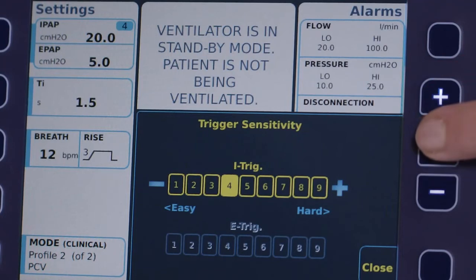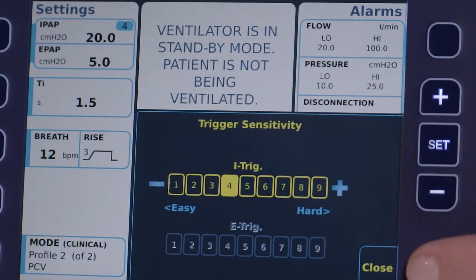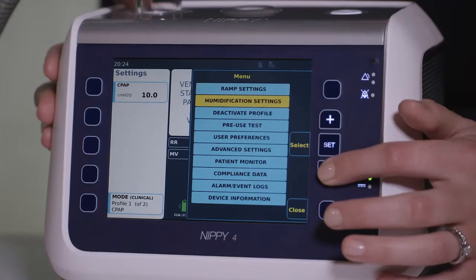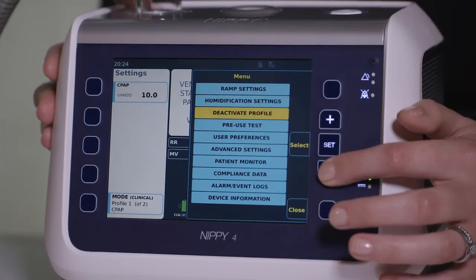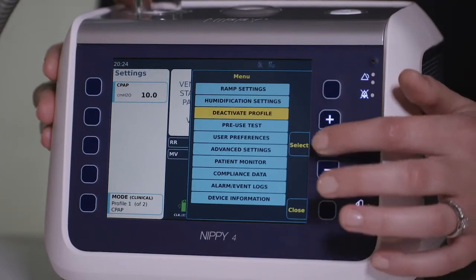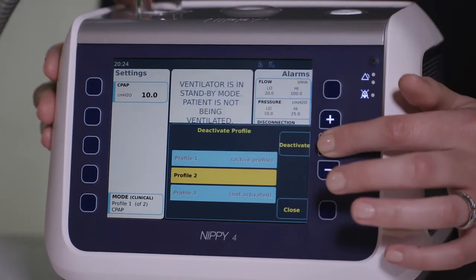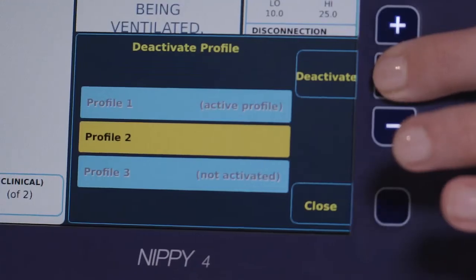In order to simplify treatment in the home, patient profiles that are no longer required for use can be deactivated in the main menu options.